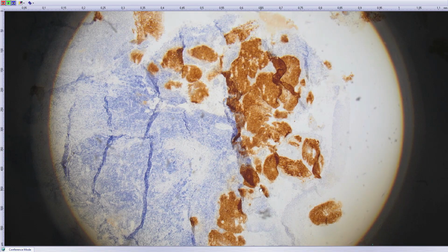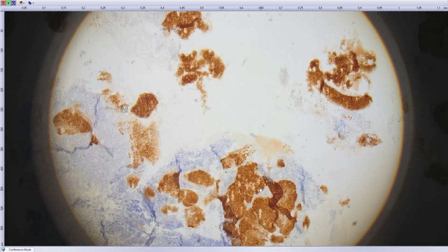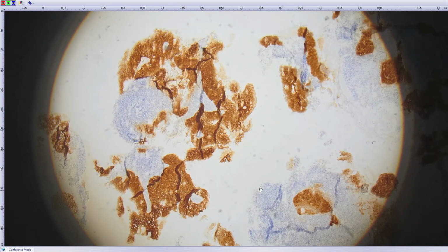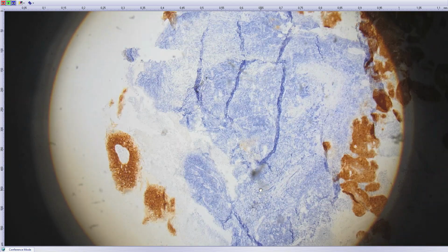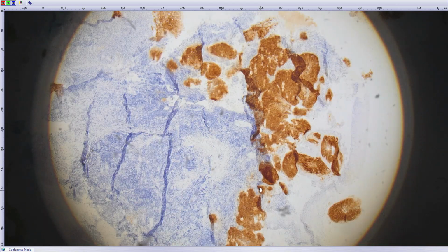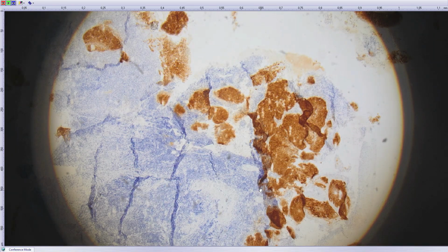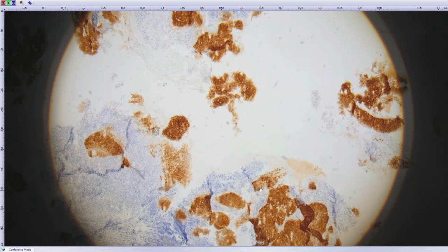Importantly, although the lesion is looking high-grade, poorly differentiated, you don't grade the lesions associated with HPV because the prognosis of the tumor is very good. And even in the immunohistochemistry, if you scroll around, the epithelium is on the surface. Okay, so it looks like inside the lesion, but there is nothing like HPV associated in situ carcinoma. You should always call it squamous cell carcinoma HPV associated with no added grade.